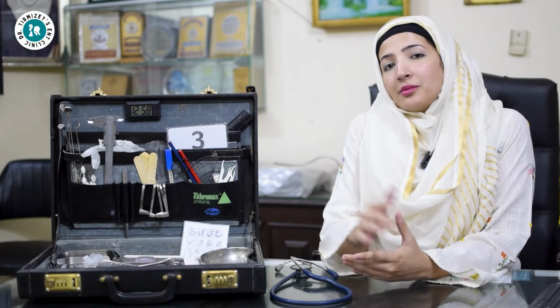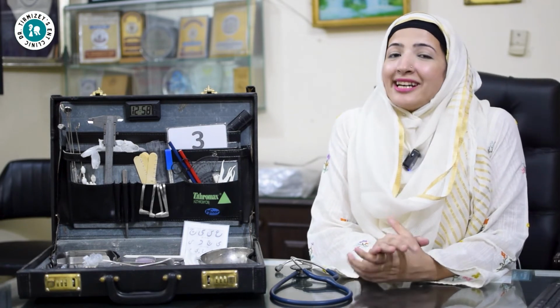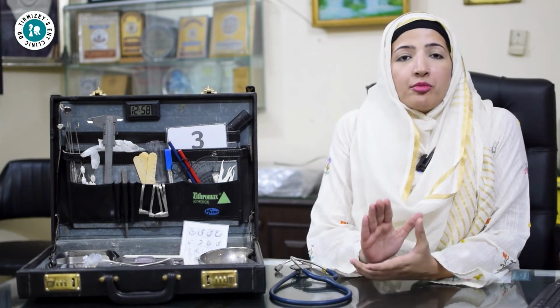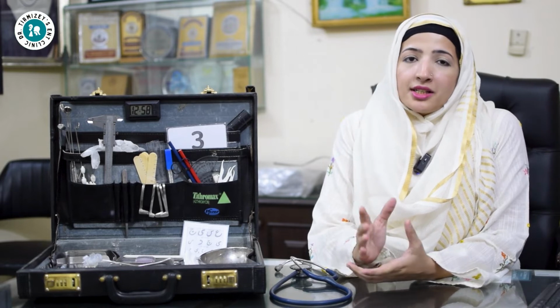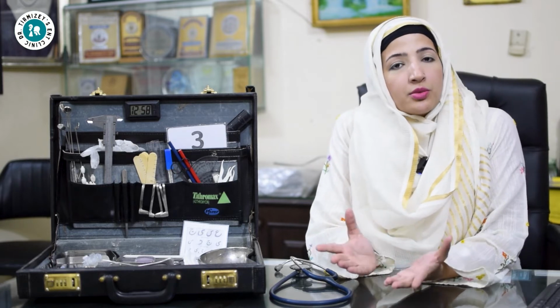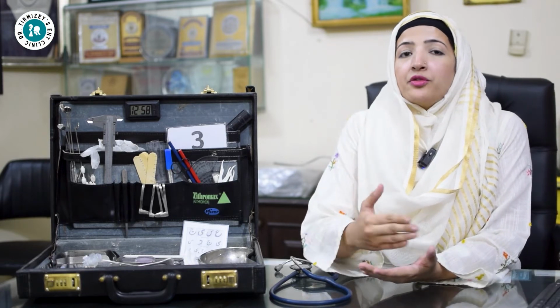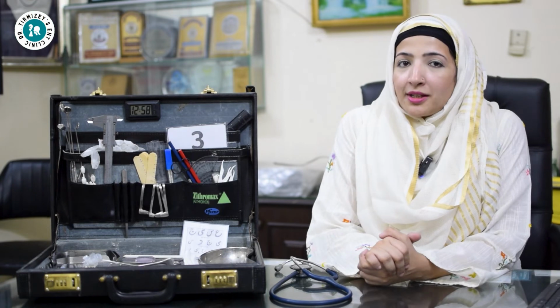But before talking about the bag, I want to talk about the other things that you need. Your headlight. You need at least 2 headlights which have been charged overnight. It gives a very bad impression that your light is out of charge and it's not working. That's why you should have 2 lights with you. One should be in your car. So in case before going to exam you check and it's not working, you can run to your car and change it for the one that's working.